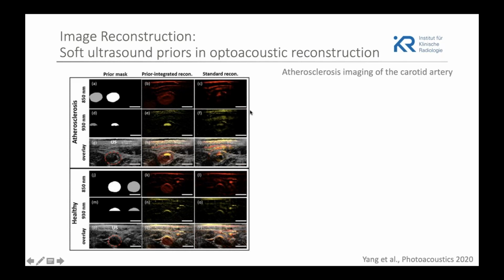We had in the beginning really problems to image the carotid artery due to this high signal at the beginning of the vessel, and compared to the radial artery, the carotid is deeper as well in the tissue, so both hampered somehow the carotid artery identification in the MSOT imaging. But maybe there will be some improvement further with these image reconstruction methods using the ultrasound imaging as a mask to reconstruct your MSOT imaging.